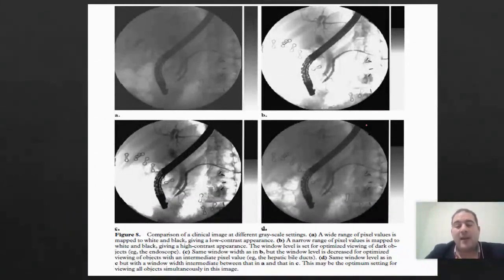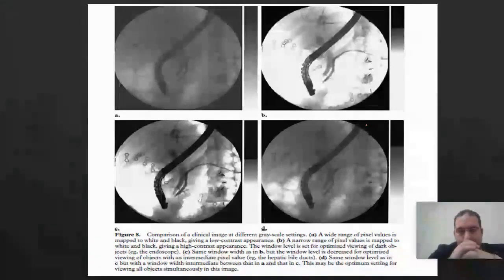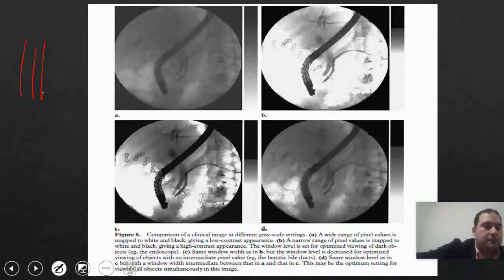I always tell you that you have a low pass filter, a high pass filter, and sometimes I tell you about a band pass filter. My image, which receives the signal, is affected by these filters. Do you remember when I mentioned the line profile?